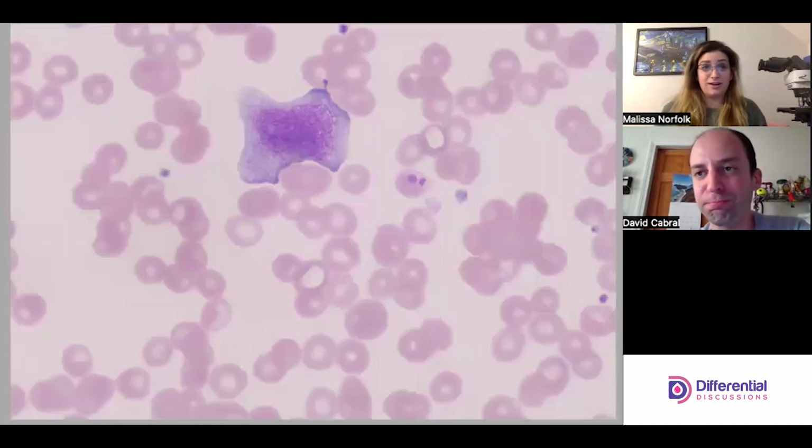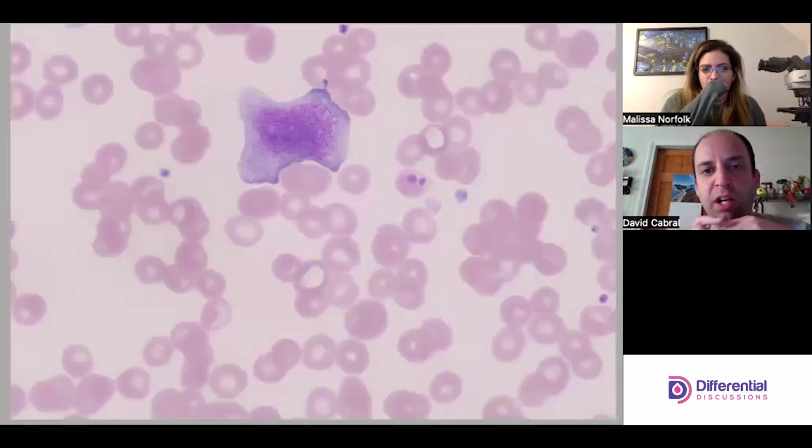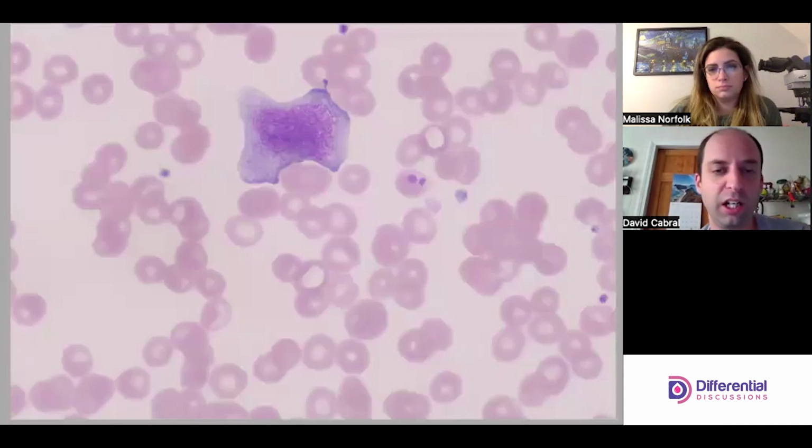And today we're still talking about leukemias. We're still talking about myeloid leukemias. We're going to talk about monocytic leukemias. We chose to start on this cell here, which looks like some kind of an immature-ish mono. I think there's enough flags here to make me think mono. And given what the label on the slide says, I'm leaning towards a pro-mono.